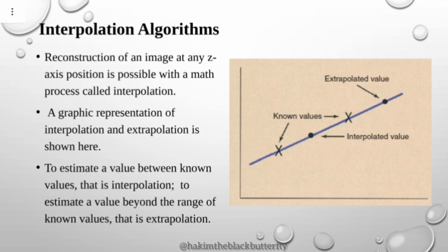But because the patient is moving and also the X-ray tube is rotating, there are some bits of anatomy that can be skipped without scanning them.